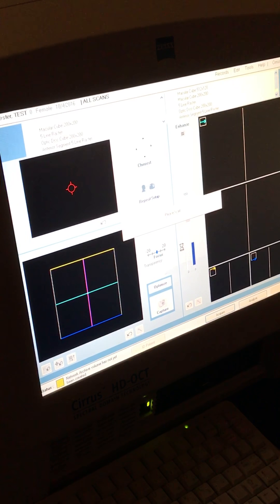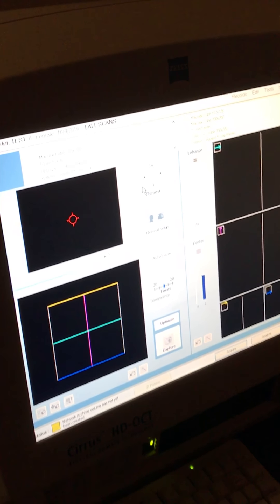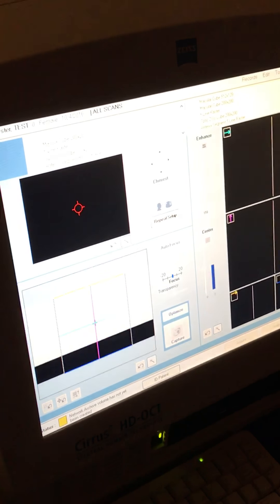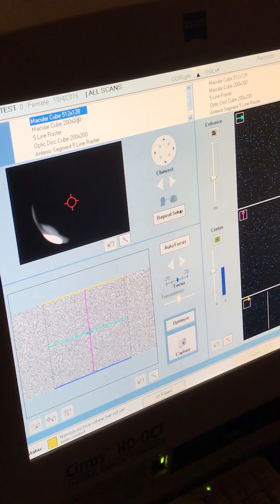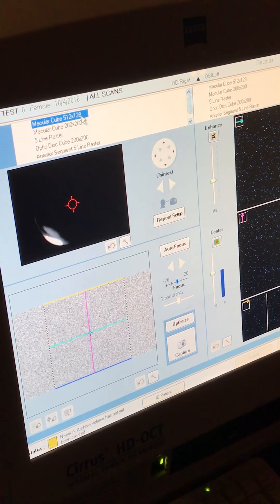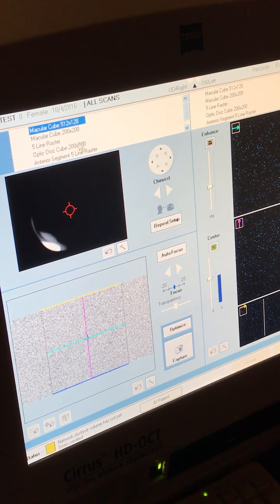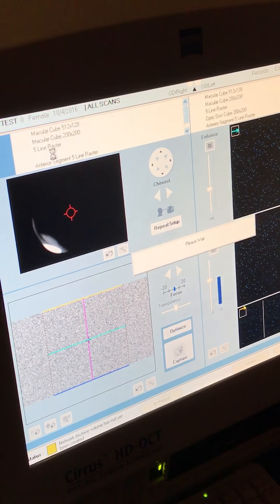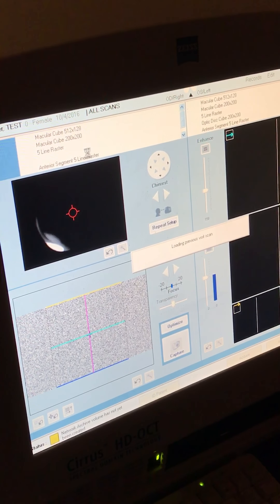When scanning an OCTR, we'll be clicking on the macular cube 512x128 and for an OCTG, we'll be clicking on the optic disc cube 200x200.